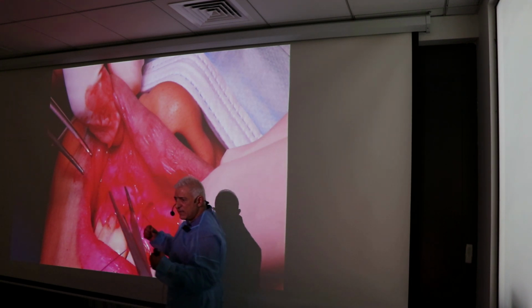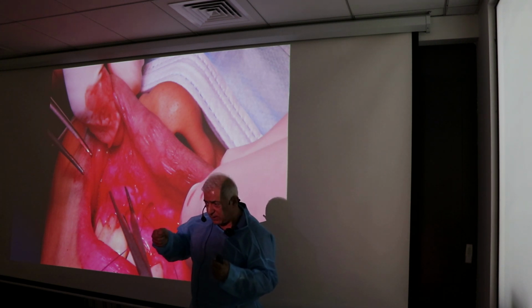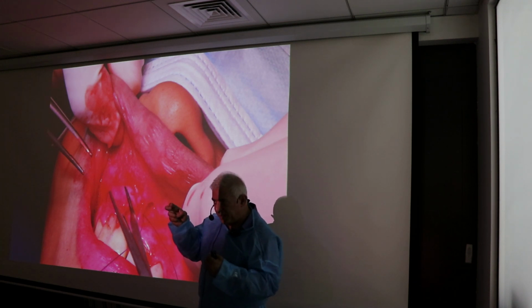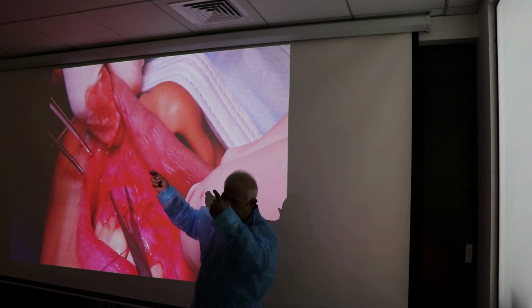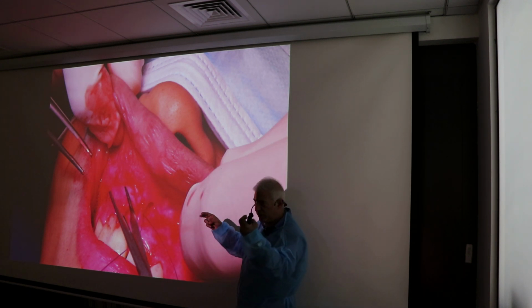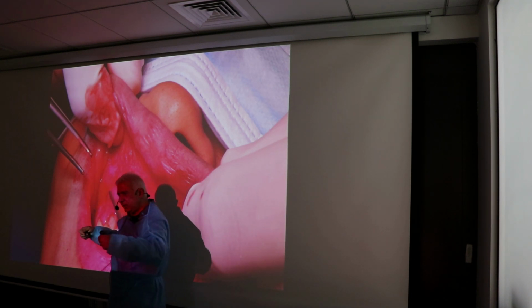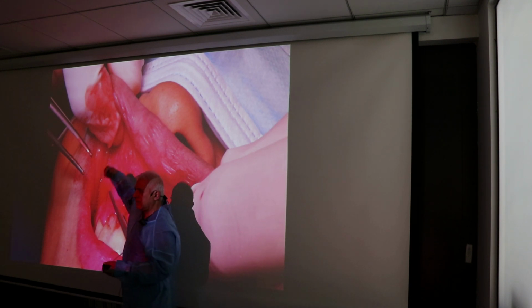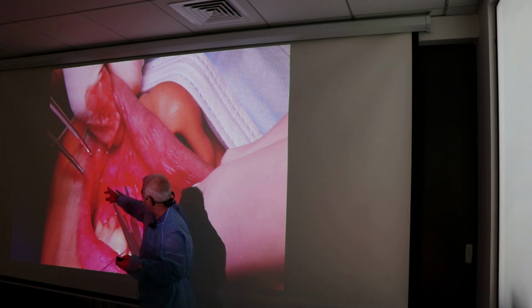When you don't have this, normally you have a straight tweezer, and it might open because you're holding it. This one is like an artery forceps, click, and it's 90 degrees. So whatever you catch, you can grab from the other end. What we did, we put a suture, we pushed it in, we found the suture here, we grabbed it, we pulled it, it was much easier. Otherwise, there's a chance that the head of that soft tissue will not come out here.